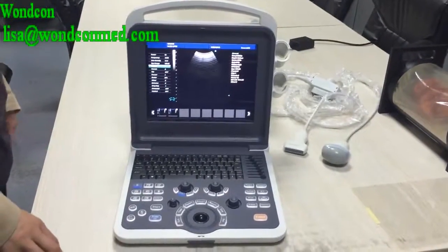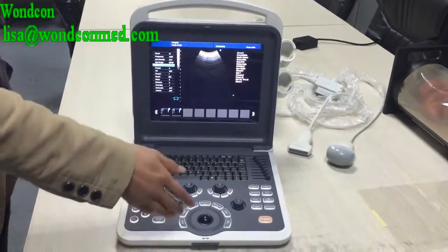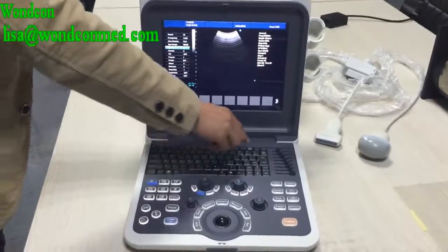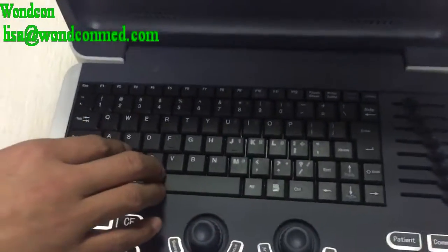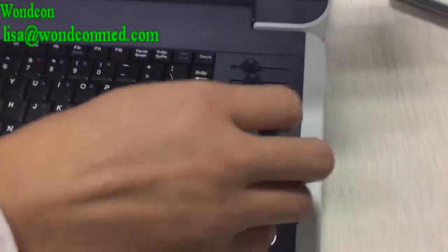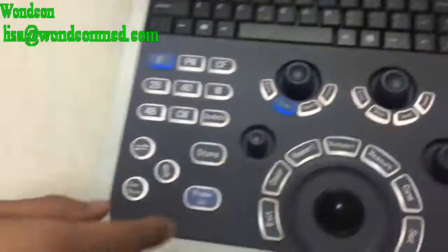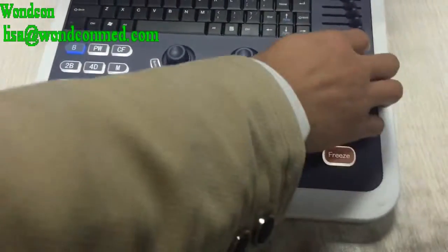Now I will introduce the operation panel to you. It's an international keyboard to input characters. This is the TGC. This is the function area.